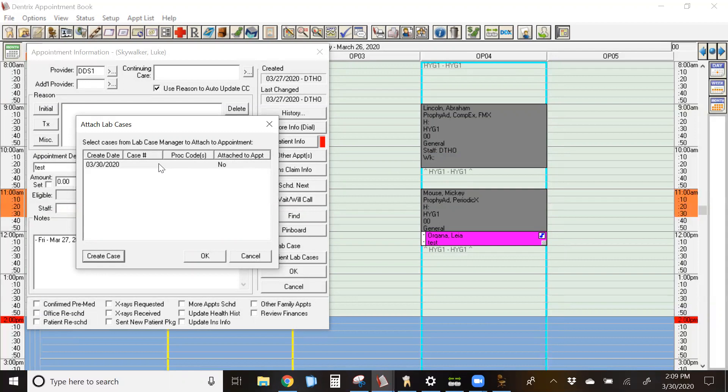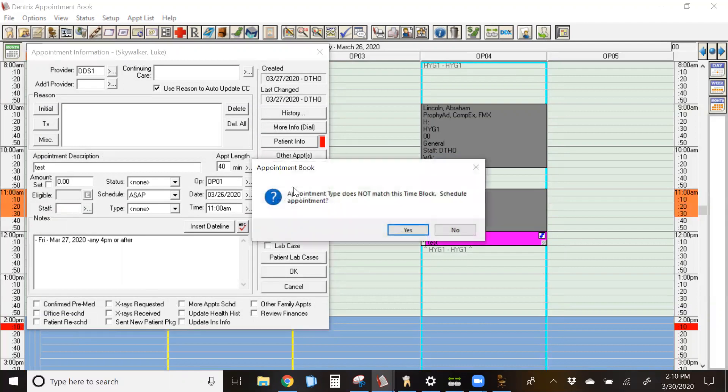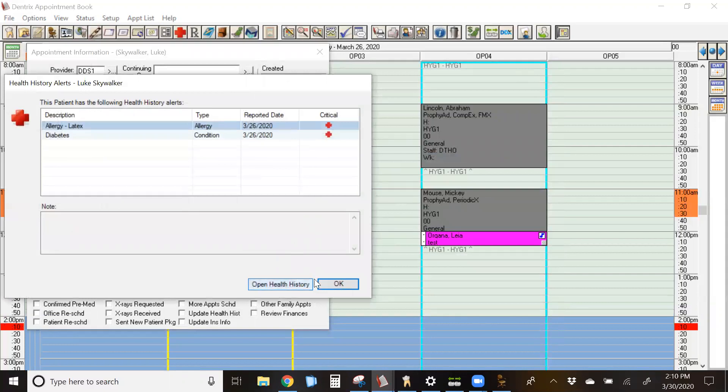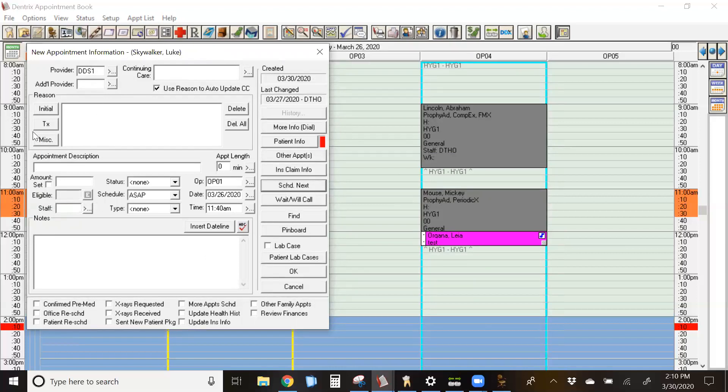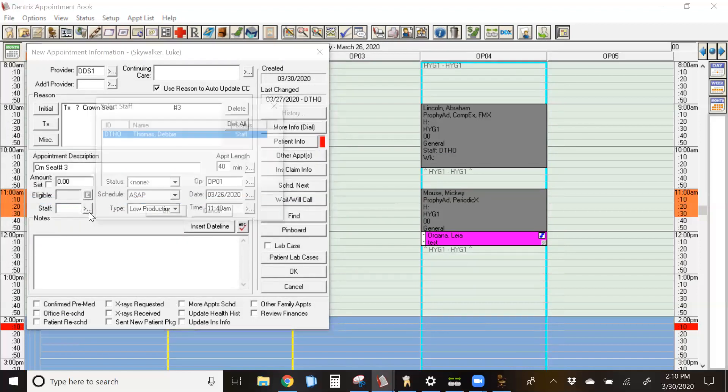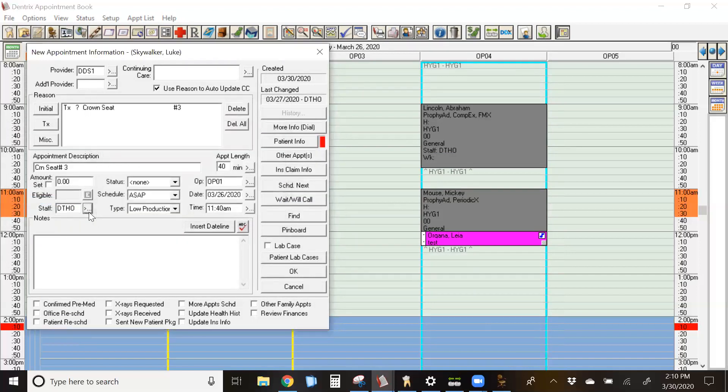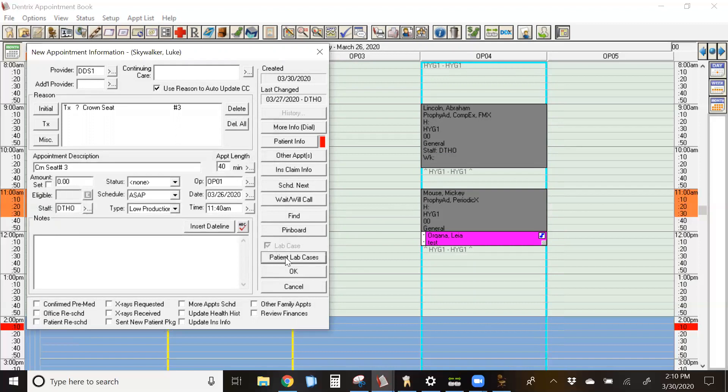This case is now available for this patient in the attached lab cases box. To attach it to an appointment, I'm going to show you that next. We're not going to attach it to the prep appointment, we're going to attach it to the seat. So I'm simply going to cancel out of that box. Now that that lab case has been created, I'm going to click on schedule next and we're going to book the crown seat appointment. It brings up a blank new appointment information box and you can fill all of your information in. I'm going to grab my crown seat. And then down here where it says patient lab cases, I'm going to click on that button. Once again, I'm going to single click to highlight the case. It will be blue once it's highlighted and then click OK.